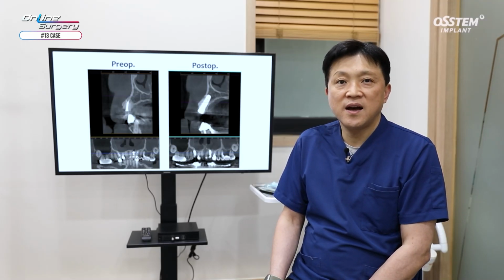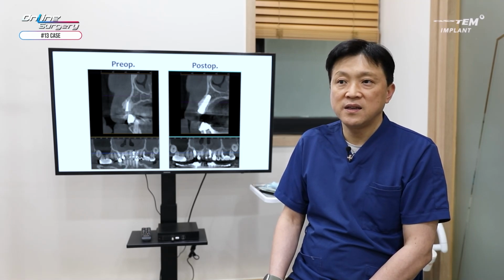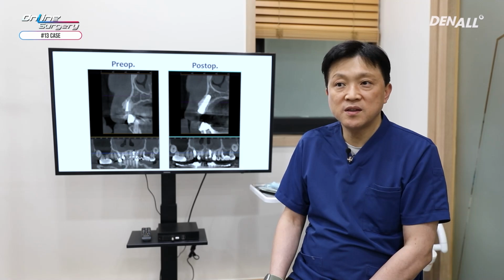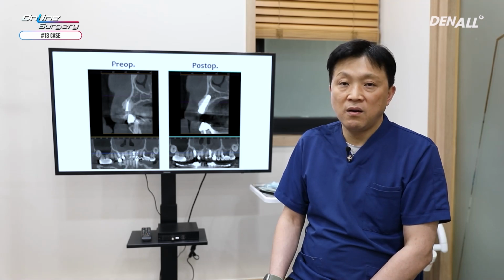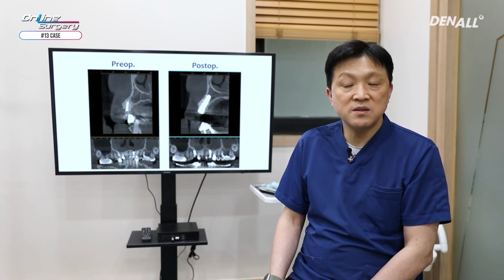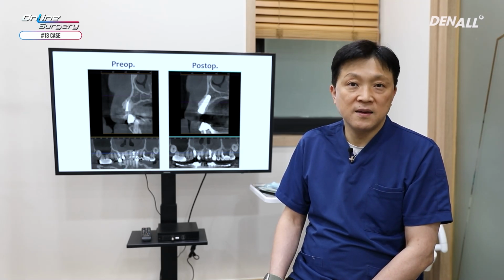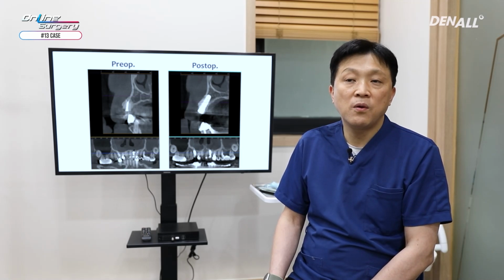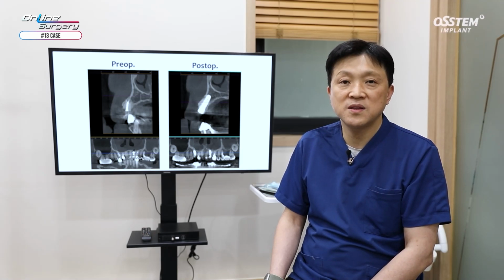Even in my case, when placing single implant in upper anterior, it can be quite difficult. In that case, if you place implant freehand, unintended errors can occur. Therefore, by using one guide or other guides, you can get better results. Rather than opening flap when there's no dehiscence defect or fenestration defect, as shown, without opening flap, you can utilize dual zone graft concept. I think this could be a great choice.